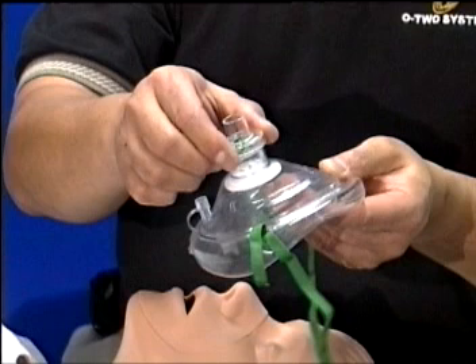The sealed air cup should be semi-inflated, not rigid, in order to provide a secure mask-to-face seal on all facial types.